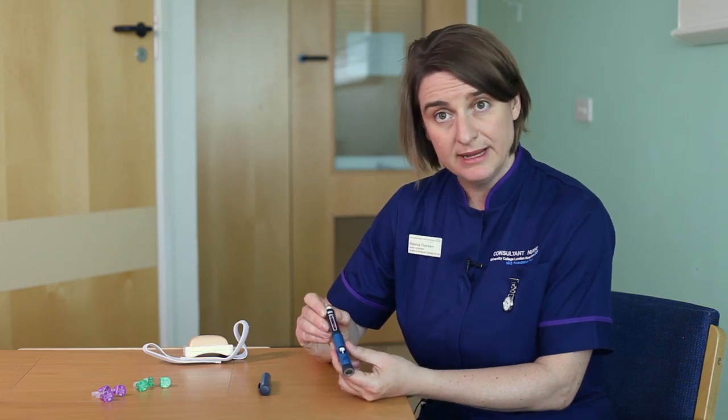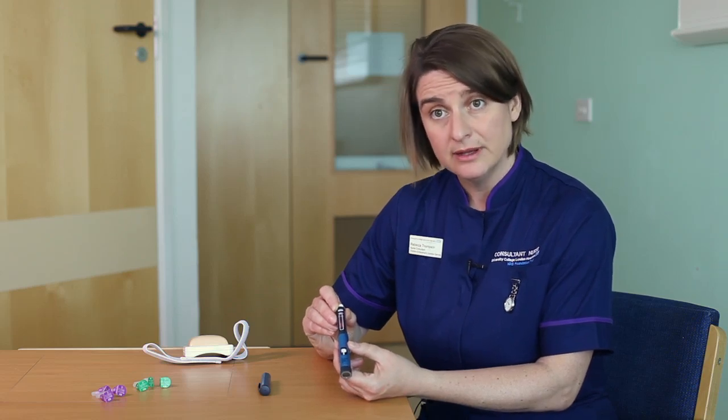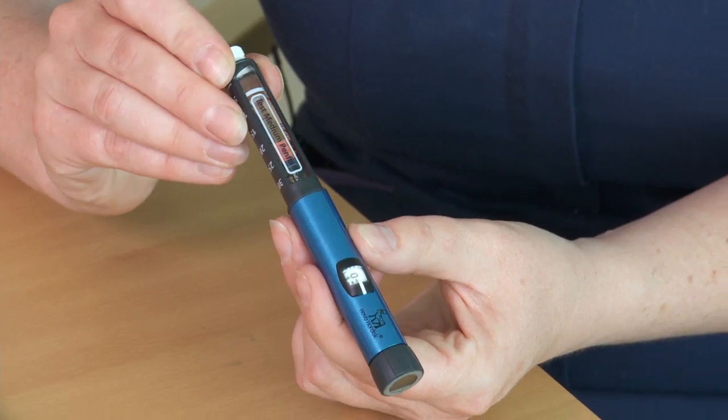Your insulin pen can be kept at room temperature for one month. Spare insulin needs to be stored in the fridge.